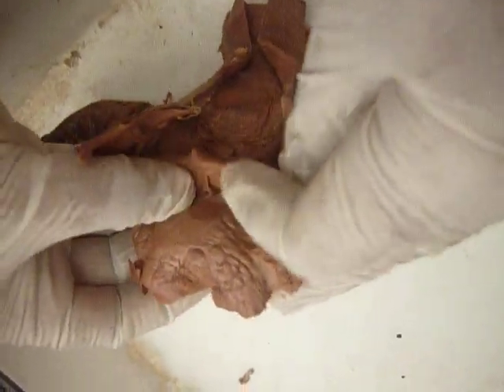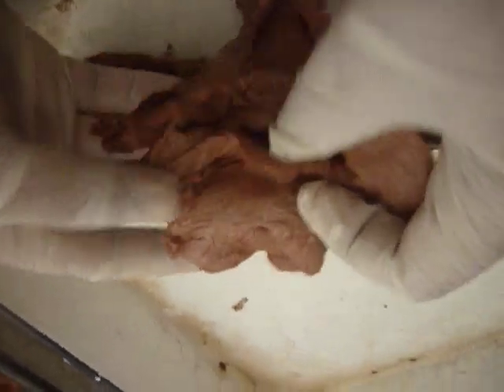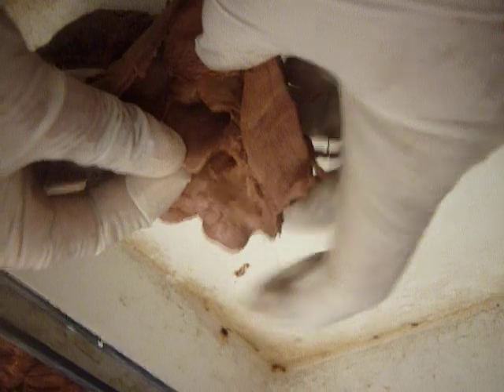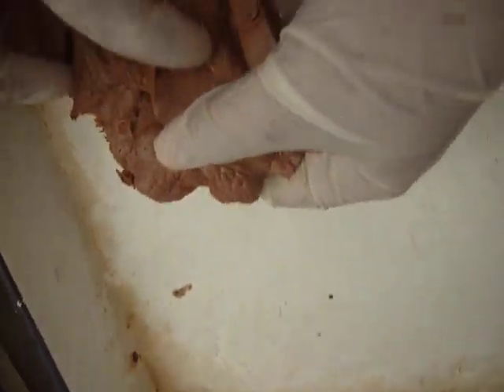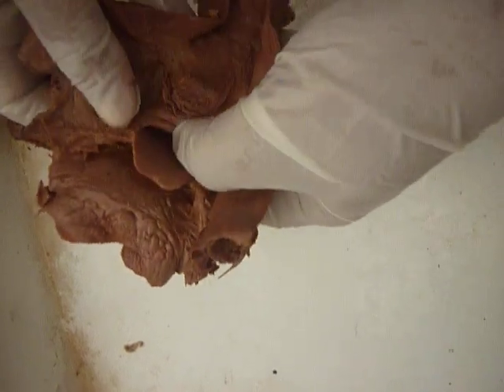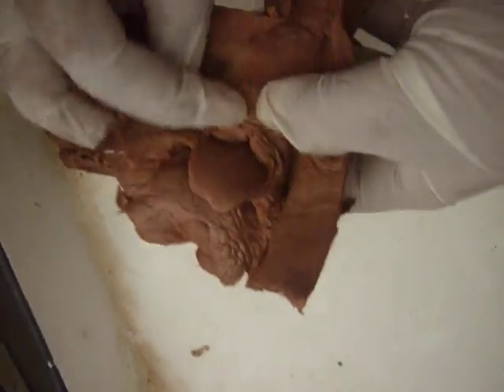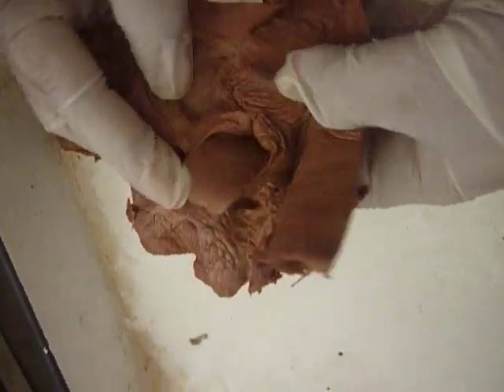What do you see? Lateral. It is the lateral glossoepiglottic fold. And you see, there is a big fold — this is a piriform fossa, and this is an arytenoid cartilage, and this is an epiglottic fold.